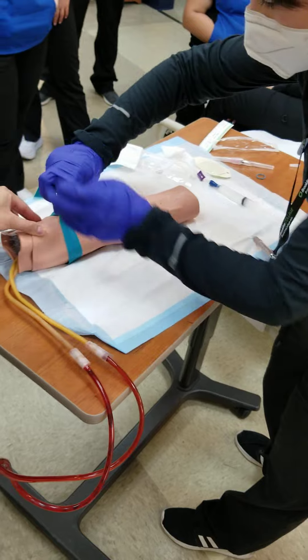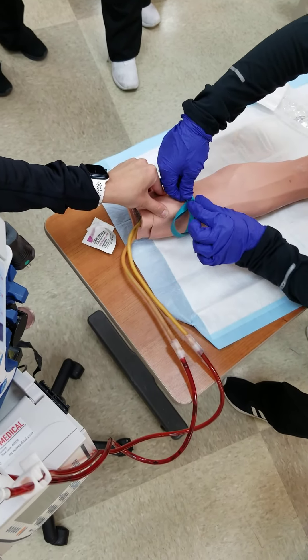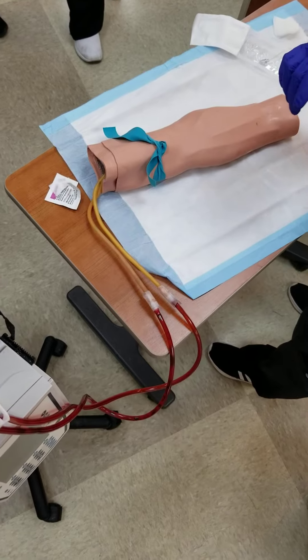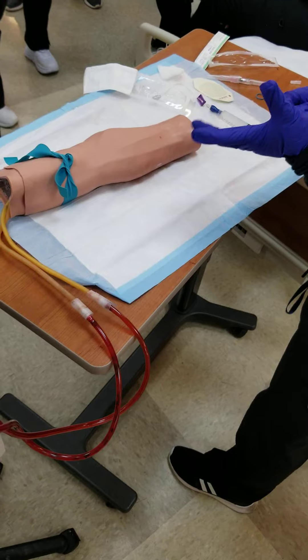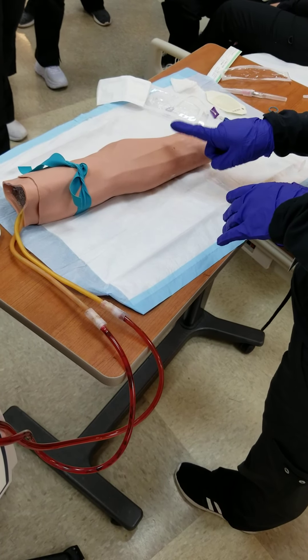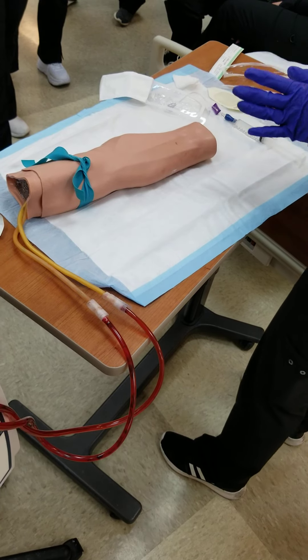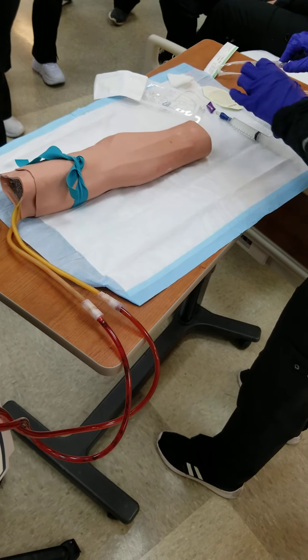Now I'm going to put this guy back on. You want to do it tight so the vein comes out right. Also, if you're doing it over fragile skin, you can put it over the gown, not directly over the skin. Now, say my vein goes away — am I allowed to touch it? No. That's clean. Some people clean their gloves and touch it like that. There's a bunch of different ways you can do it, but don't do it here.